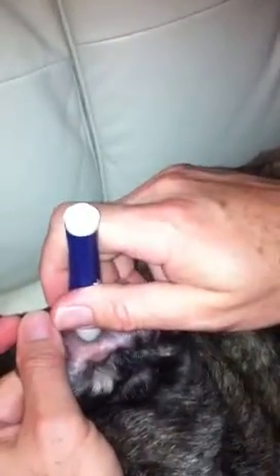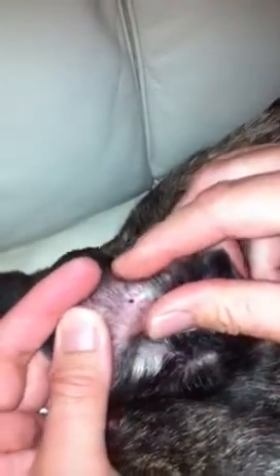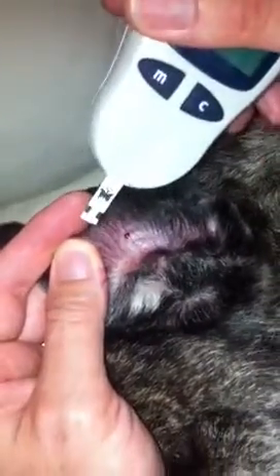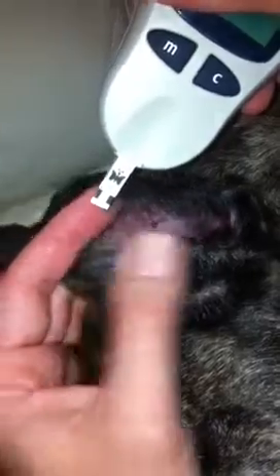Hi Sheila. We just find a spot in the middle, apply a good bit of pressure, click, and there's a little bit of blood — but that's not enough. So you just squeeze gently around it until you get a little drop like that, and then you just take the corner and dab it where the black thing is next to the little butterfly.